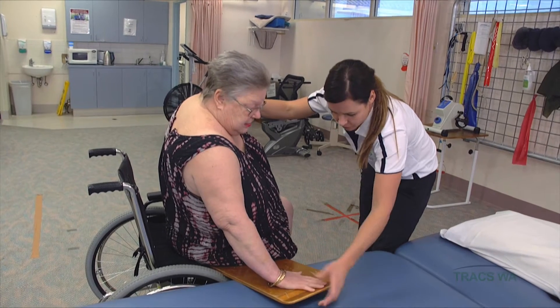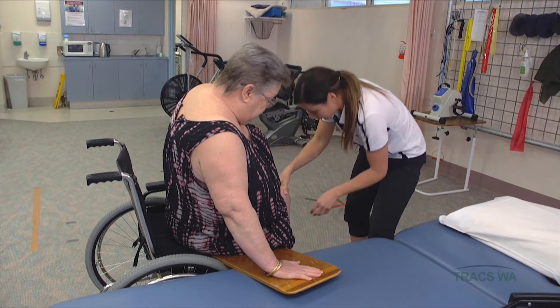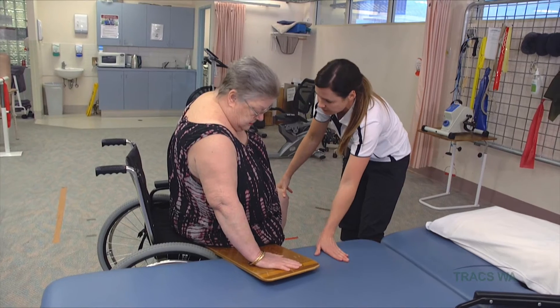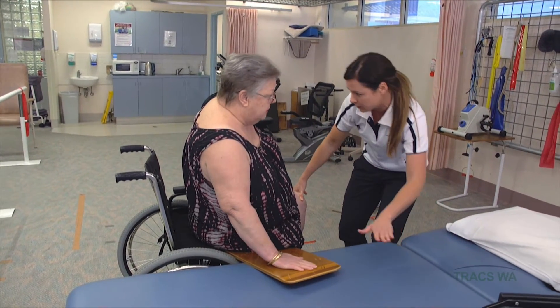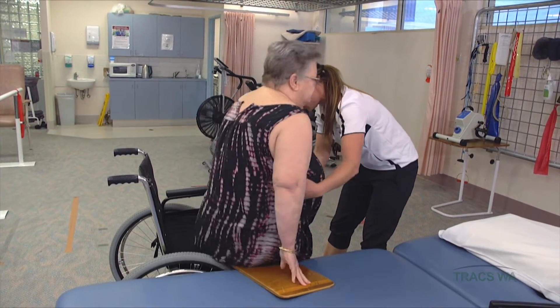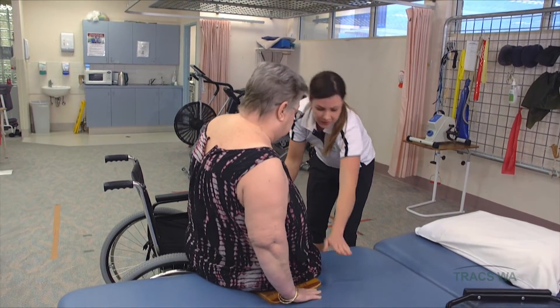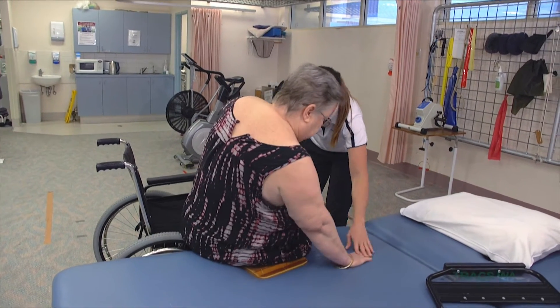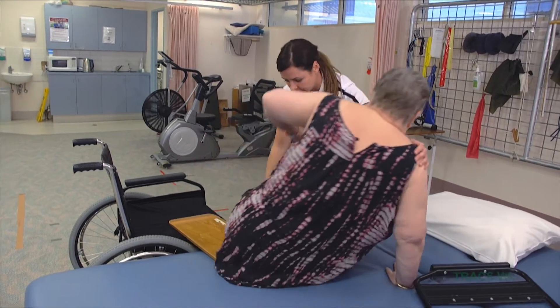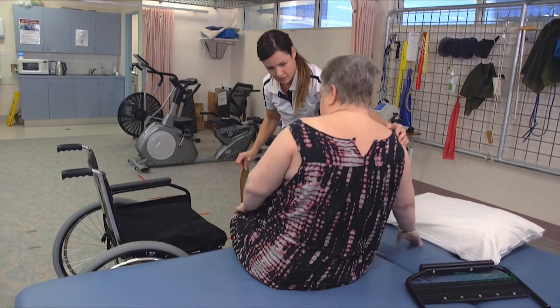Pop your hand a little bit there — don't put your fingers underneath the board. While I stabilise this leg on the box, you're going to bring your bottom up and across and onto the bed. Try not to slide your bottom across. I'm going to help you — in your own time, off you go. I'll just reposition your foot. Forward and up — bring this arm here. We'll do it one more time: forward and across, and then try to straighten yourself out. Lean over towards me a little bit and you can take that board away.